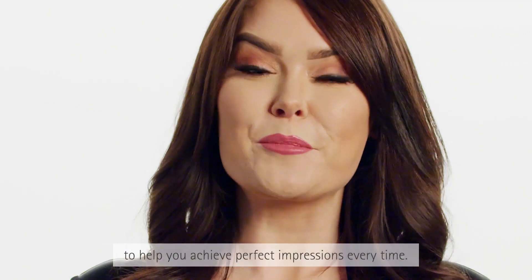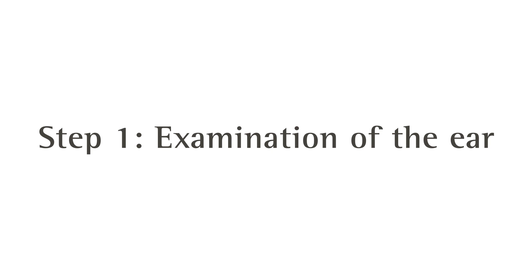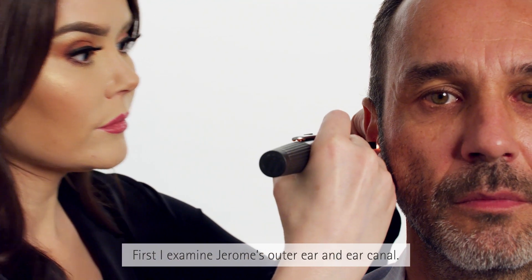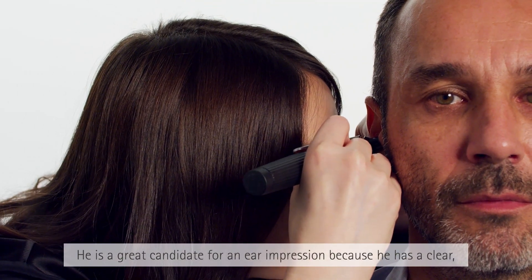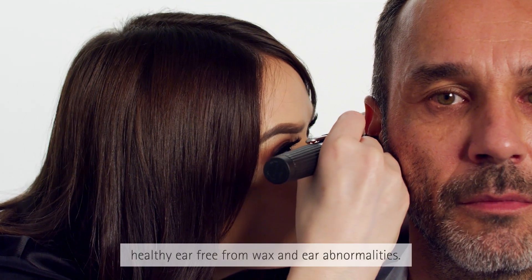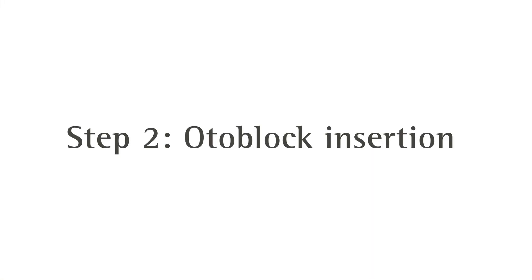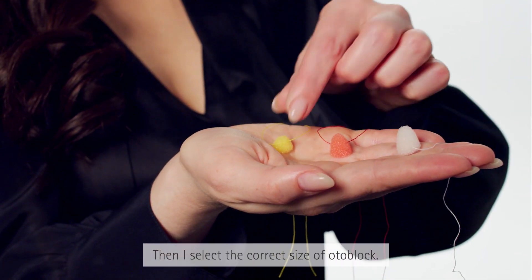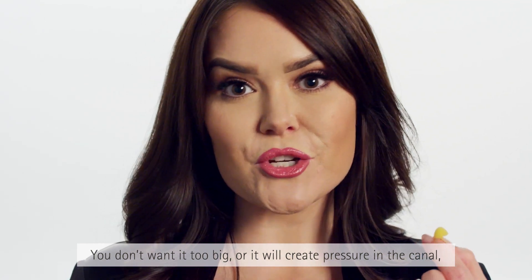That's why we at Phonak have created this easy tutorial to help you achieve perfect impressions every time. First, I examine Jerome's outer ear and ear canal. He's a great candidate for an ear impression because he has a clear, healthy ear free of wax and ear abnormalities. Then I select the correct size of Otoblock.